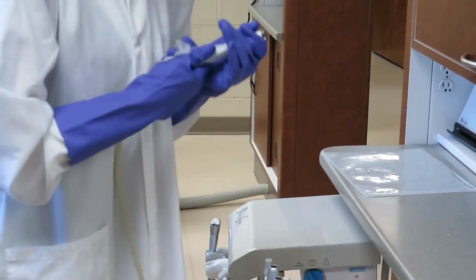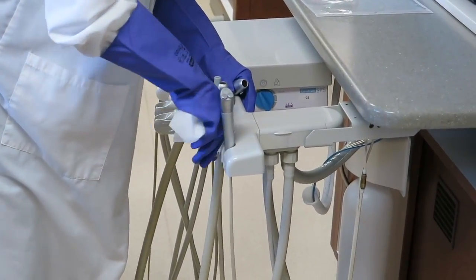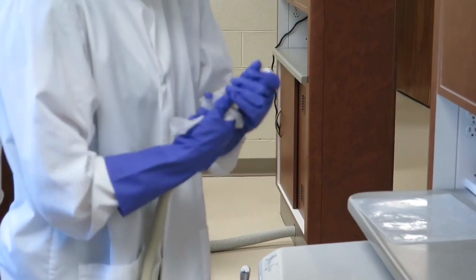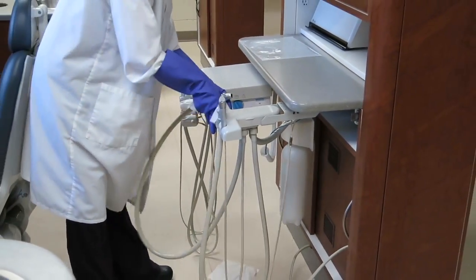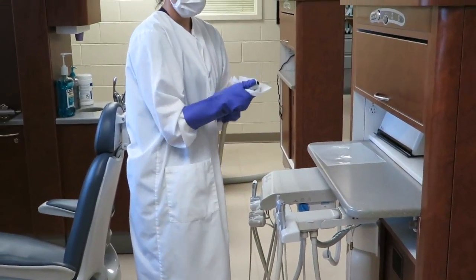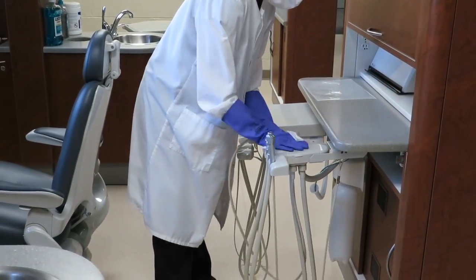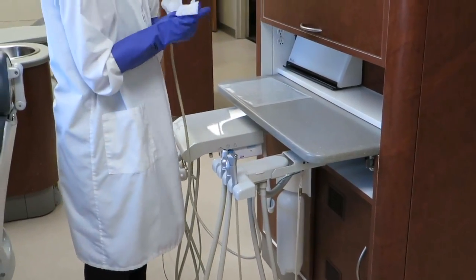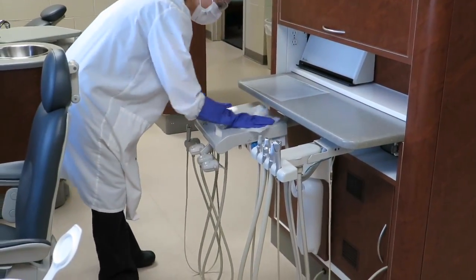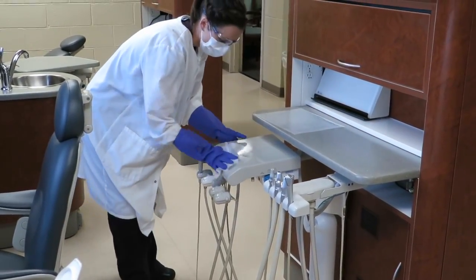It is important to not only wipe the air-water syringe, but also the tubing and inside of its carrier. This will need to be done for all items, including the suctions and handpiece hoses. These items will have many areas for bacteria to hide, so be sure to clean them well.